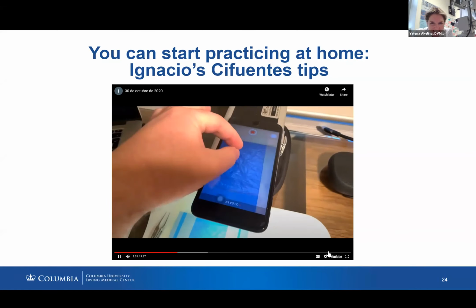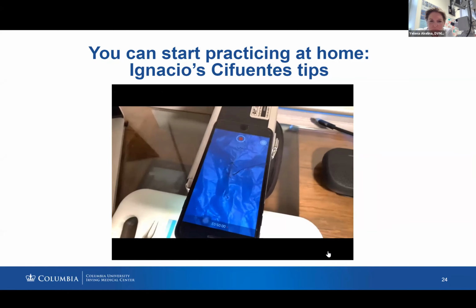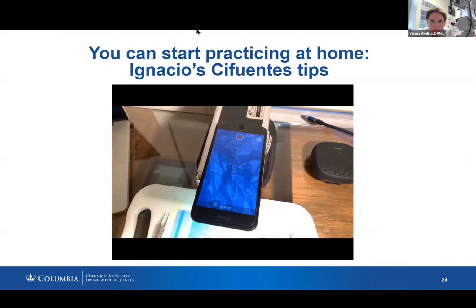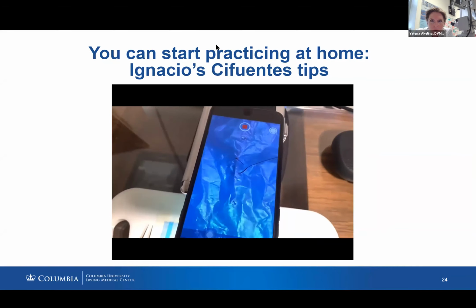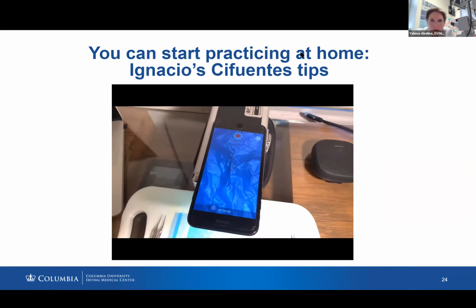I can zoom it, as you see, up to 6 times in this iPhone model, which has 2 cameras. But many smartphones nowadays have a lot of zooming. So you can see there how I was doing some knots with 9 zero sutures. And you can see it's actually very good. The thing is, the video is kind of heavy. 30 minutes of recording is like 2 gigabytes.